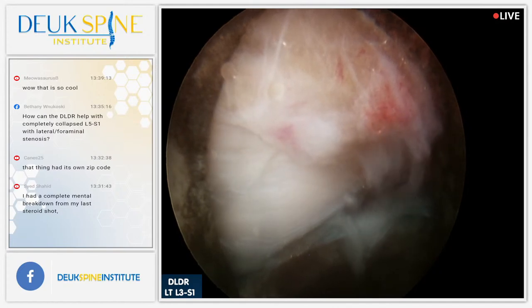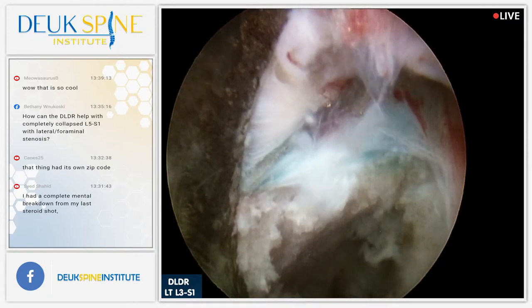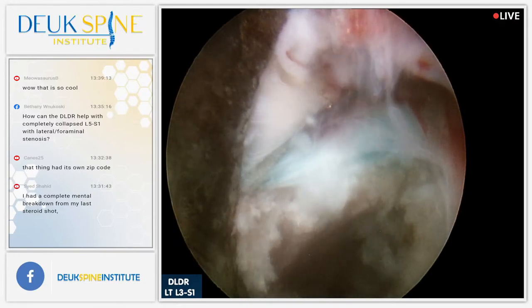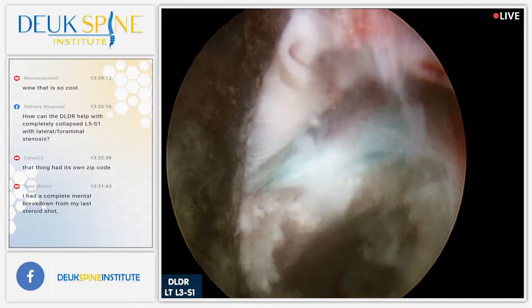You got it? Yes, got it. All right, and then one more right there. Get that, and then I'm going to shut the irrigation off, see if it makes it better. Tell me when you got it. Got it. Shutting off the irrigation, that makes it worse. All right, so one more, and then we'll call it.